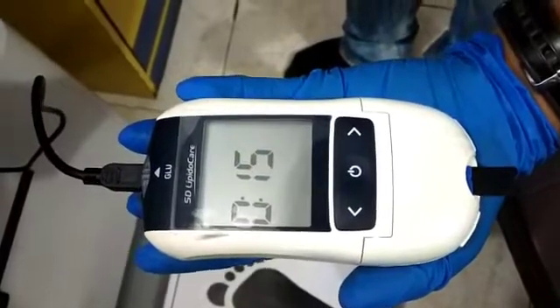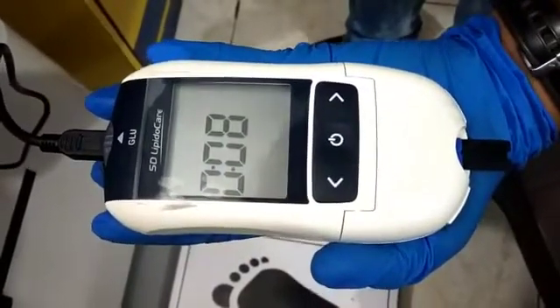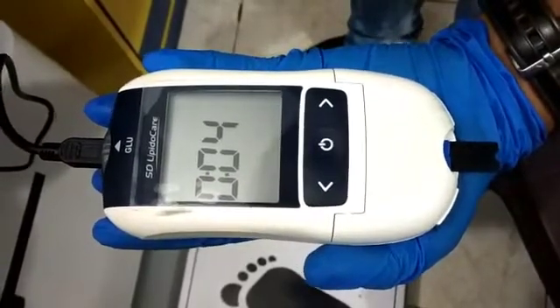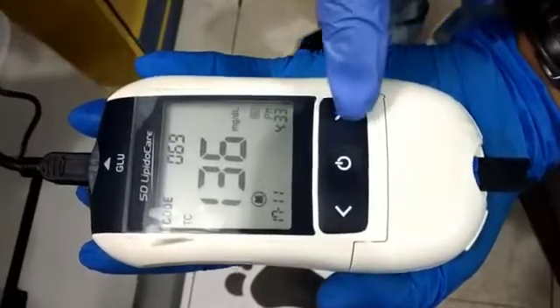Now 15 seconds are remaining. Now it gives the result. This is the result.